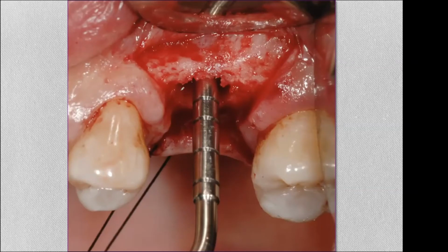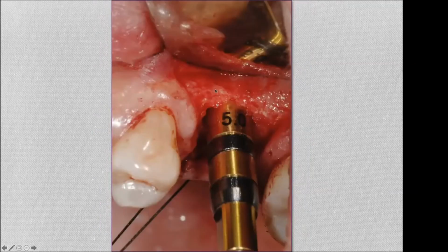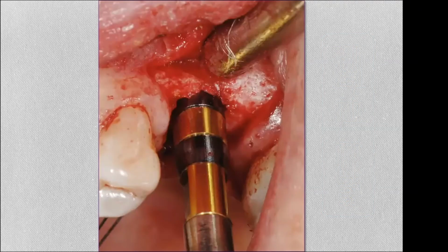So measuring the depth at the edge of the osteotomy, it's still about 4 millimeters. We take the implant osteotome. These are called the trumpet or the Bicon osteotomes. Those have an outward flare, and that outward flare allows us to fracture a wide disc, maximizing the surface area and thereby minimizing the risk of perforation. Okay, introduce it. It will sit also more shallow because, again, the osteotomes come to a funnel edge. So this sits at the top of the funnel, not at the bottom of it. And then we brace the patient's kind of bridge of the nose so that they are not rattled. And then tap until you hear or you see the floor of the osteotomy give out.